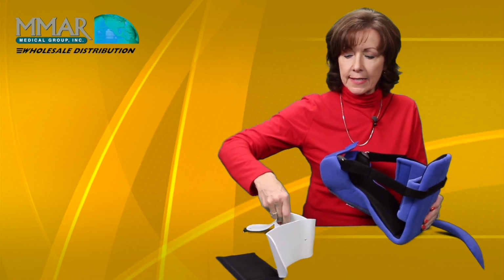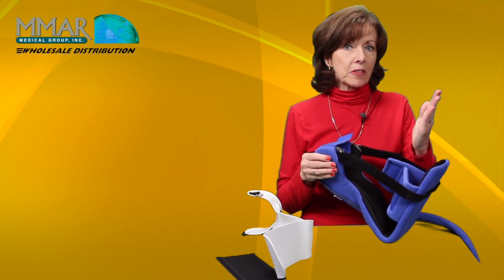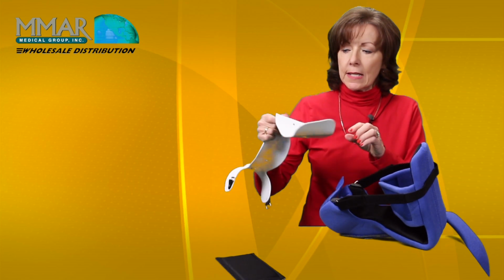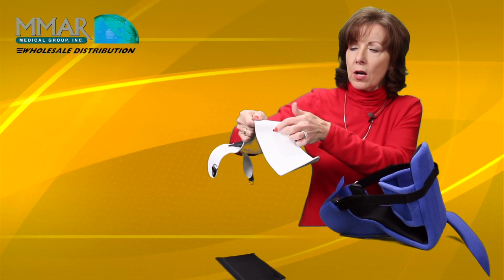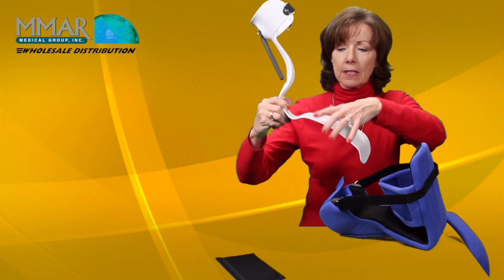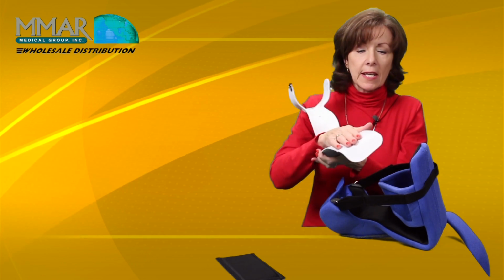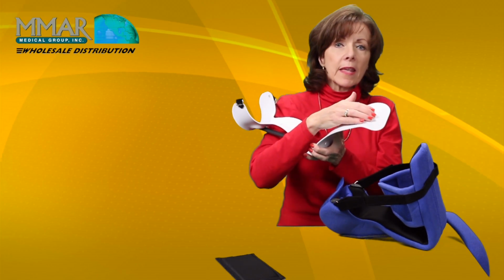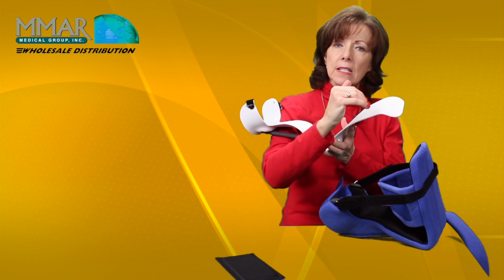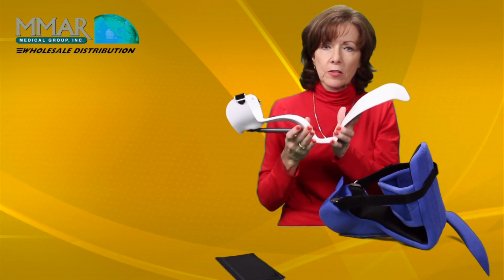Okay, for this, let's say we already have our heat molding done if we need to. My rule of thumb is if I'm lacking even 15 degrees of being able to bring that foot up to normal, I'm going to heat mold the plastic. And you just go right about where this hole is. It's about a half inch from where the heel, the sole hits the surface. And I'm going to mold it there and bend it down to meet the sole of the patient's foot. If their toes are firing down in extensor tone, then I'm going to mold that down. It's just like a hand splint. We want them to be able to pull into the tone with that mild resistance that brings them back, and in about 15 minutes, maybe less, you will see them relax. So that's very important.